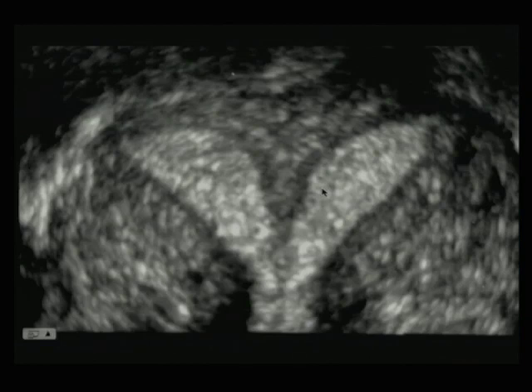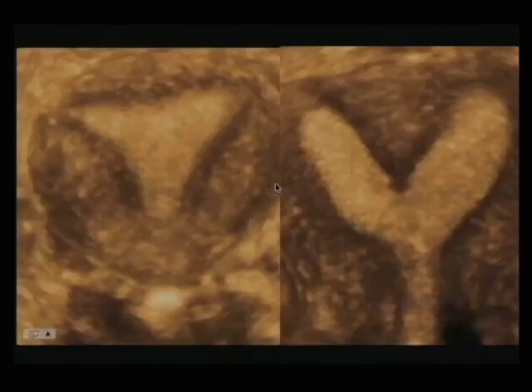Now, the coronal view of the uterus is also very important to look at the shape of the uterine cavity. And here we have a uterine cavity which is abnormal. You have a septum right in the center here, dividing the uterus into two horns right here. But this is not a bicornuate uterus. This is a septate uterus, because the top of the uterus, the top of the fundus or the myometrium, is actually straight. There is no indentation up here to match the indentation of the lining. And therefore, this is a septate rather than a bicornuate uterus.